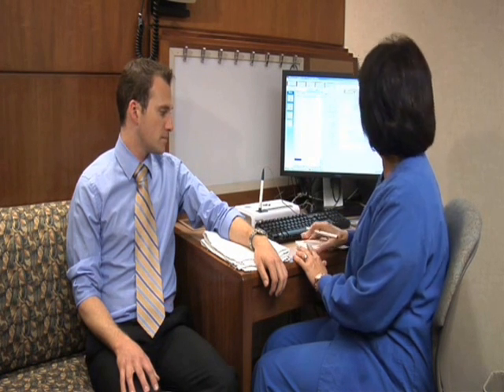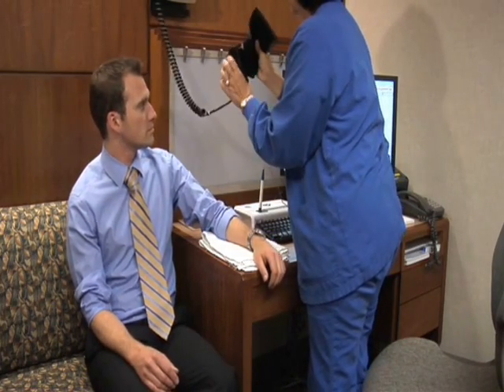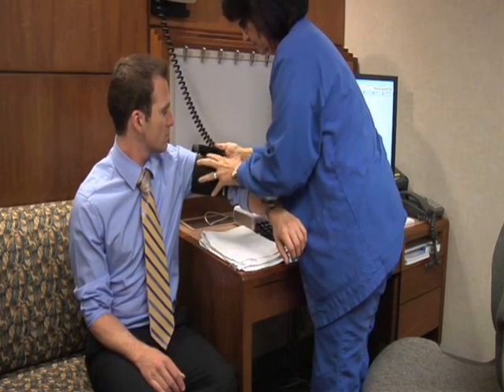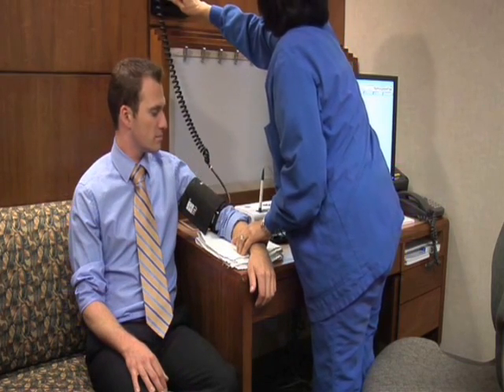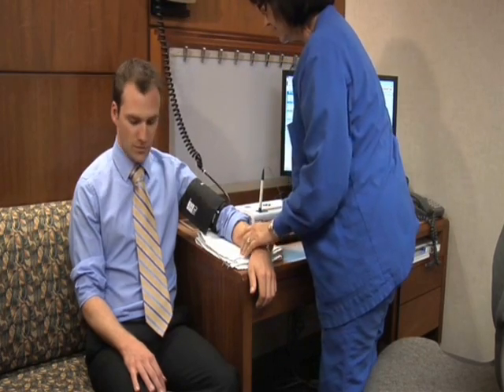All right. With that said, I will start the blood pressure machine and step out of the room. Just relax.